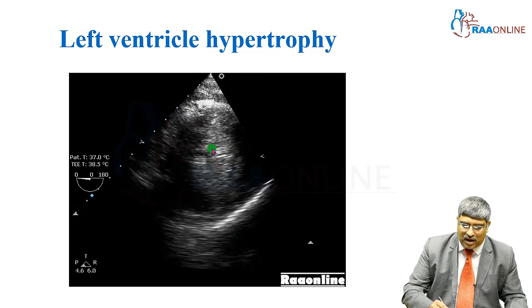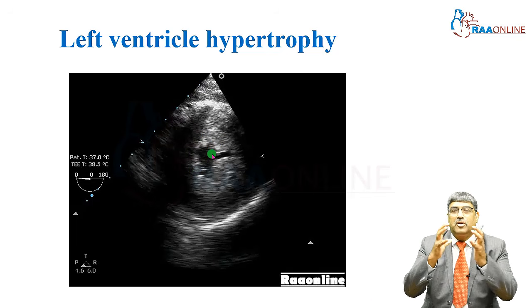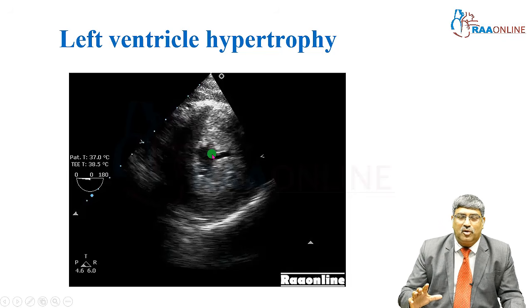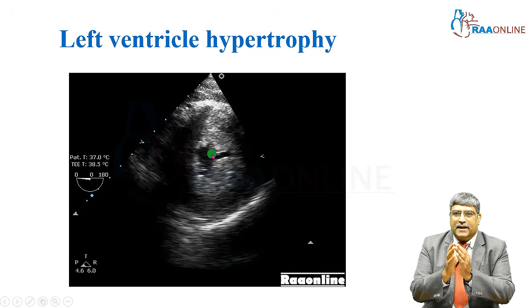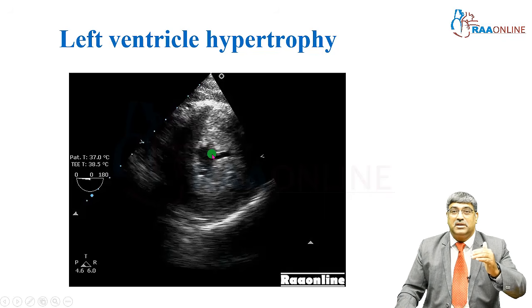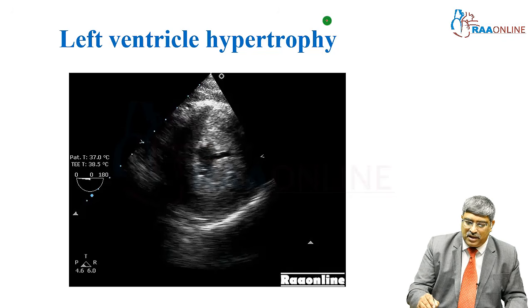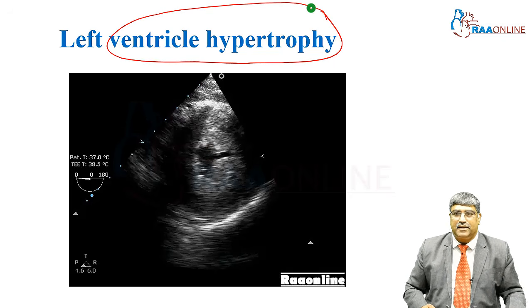Here you can see hardly any ventricular cavity. The ventricular cavity doesn't exist. Severe hypertrophy of the muscle mass is there. These are the cases where you should be very careful not to reduce the afterload. If you reduce the afterload with the neuraxial blockade, the entire left ventricular cavity will collapse and the patient will have dangerous hypotension, which is refractory to any treatment. So, always look at the hypertrophy degree in an echo report and accordingly plan your anesthesia technique.